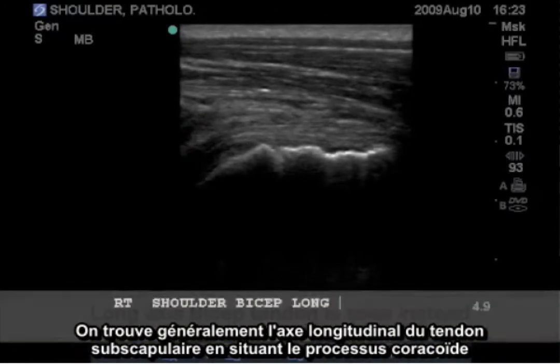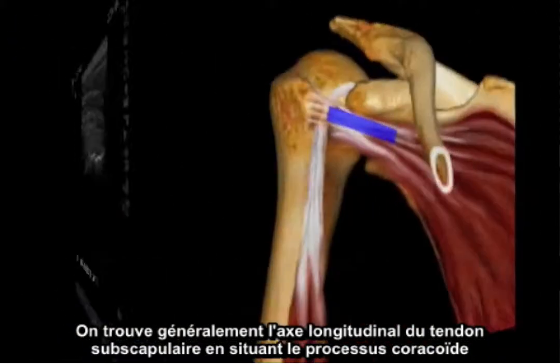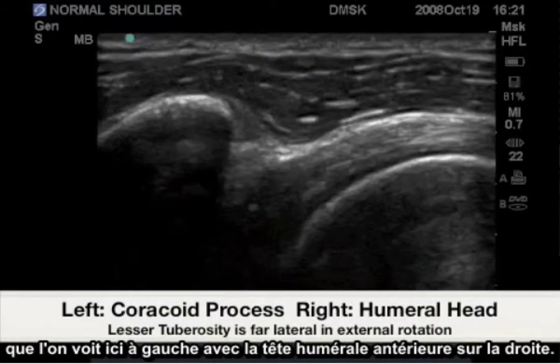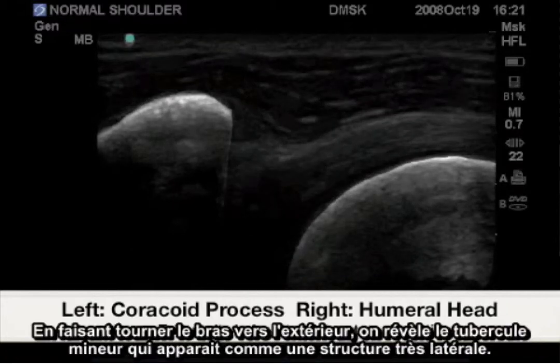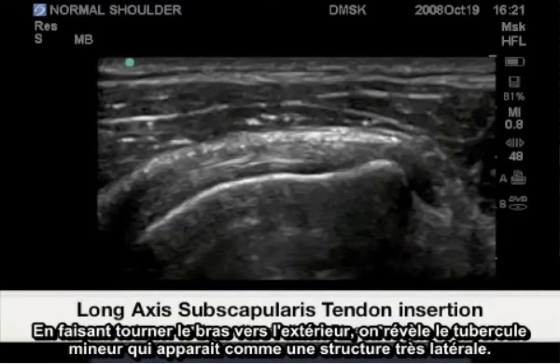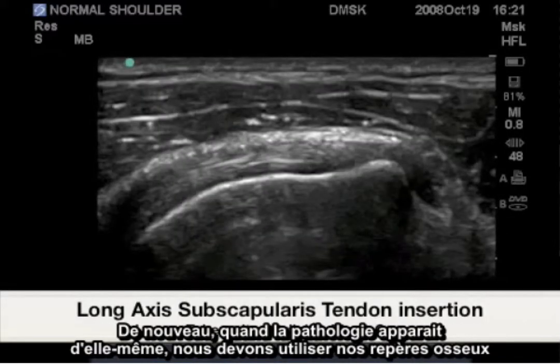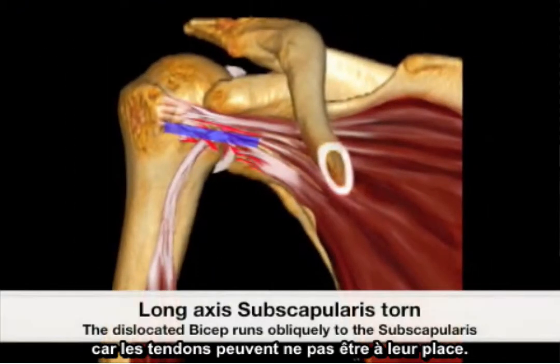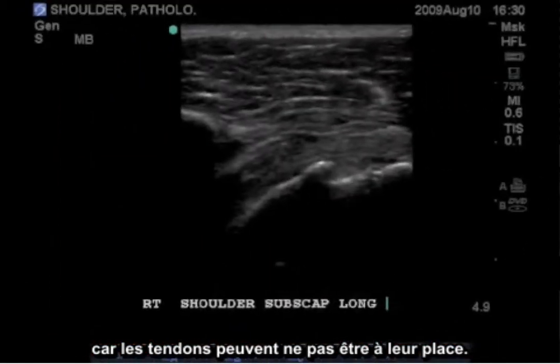The long axis of the subscapularis tendon is generally found by locating the coracoid process, shown here on the left, and the anterior humeral head on the right. Externally rotating the arm reveals the lesser tuberosity becoming a very lateral structure. When pathology presents itself, we must rely heavily on our bony landmarks, as the tendons may not be normally situated.